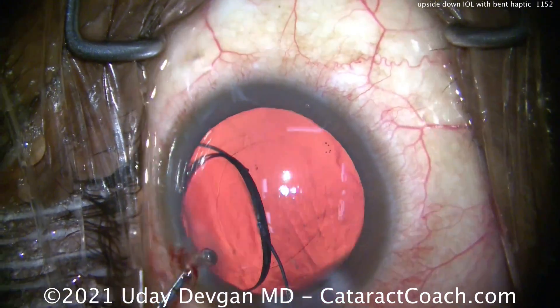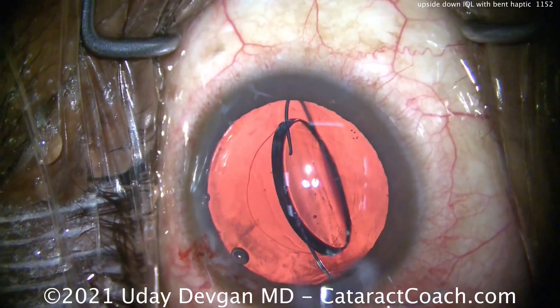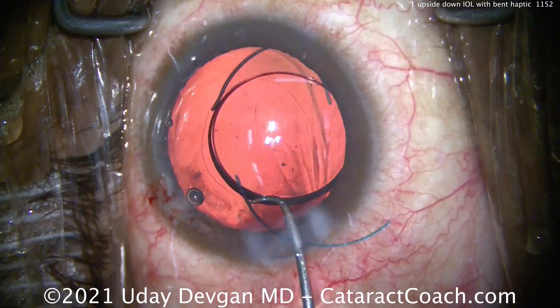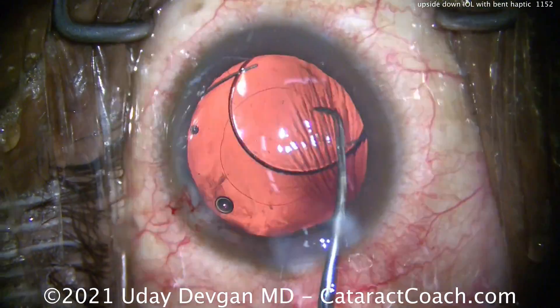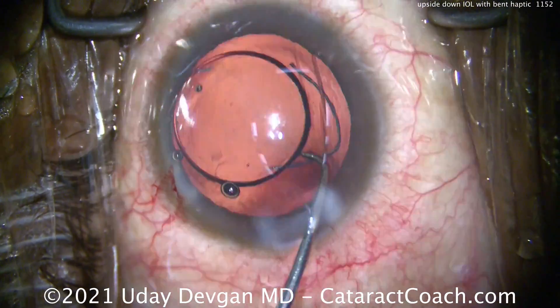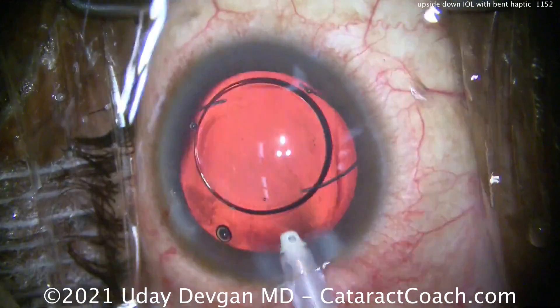The lens was misloaded, and even the leading haptic was bent during the process. We have a scrub tech who is new and confessed she was too shy to speak up about loading this lens — she didn't really know how. That's unfortunate, but what are we going to do now?